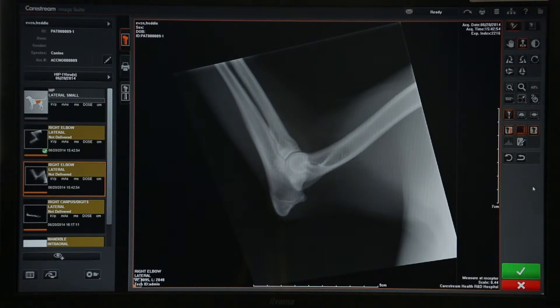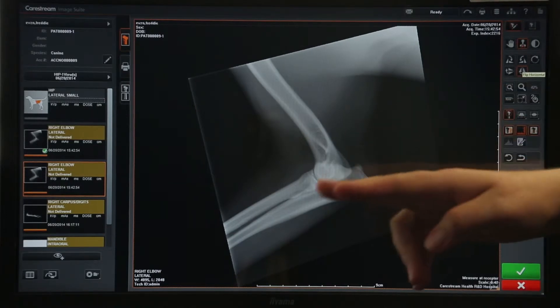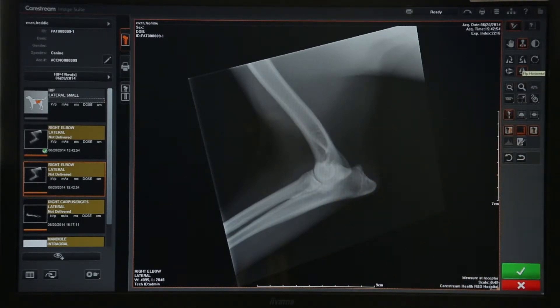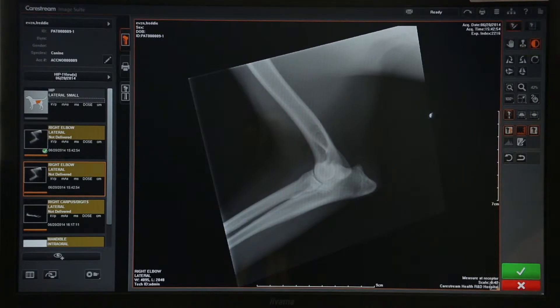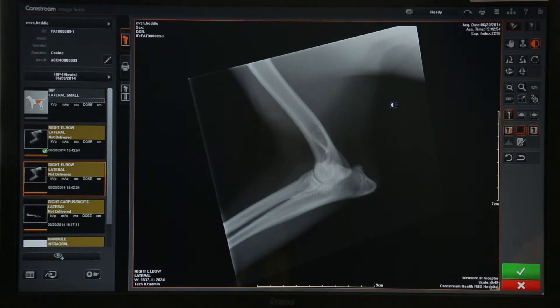Once you've processed your plate, your image will come out and you can nearly always guarantee it's going to be the wrong way up. So the first thing to do is use one of these icons to rotate or flip the picture depending on what you need. Ideally you want your animal walking off the left hand side of the screen. You can then play with your brightness and contrast using the window width and level button, but ideally you shouldn't need to make many changes here because if your exposure settings are correct the picture will come out looking nice.